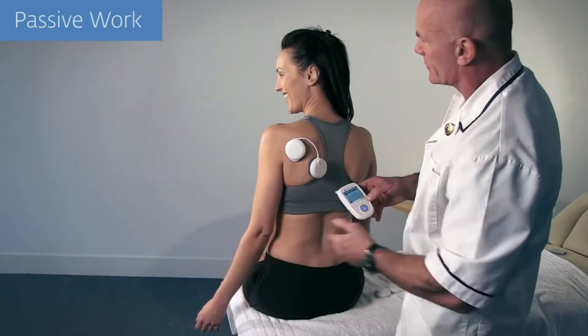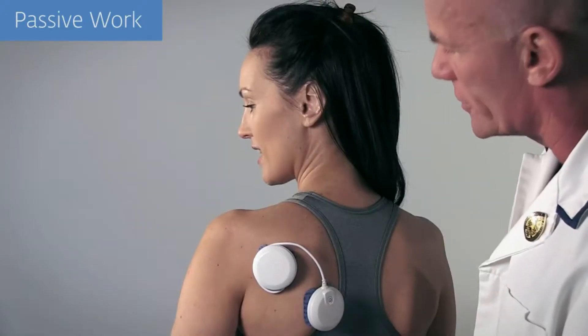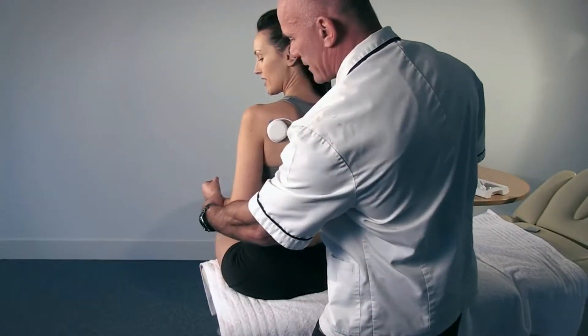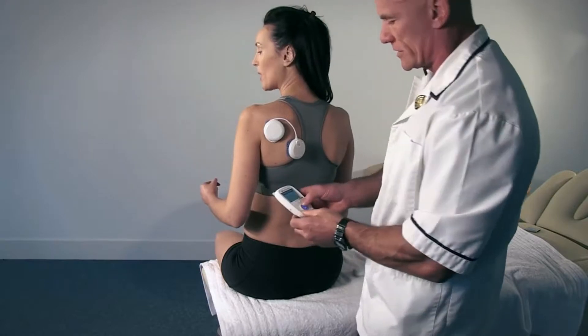The external rotators can then be worked isometrically using the internal rotators to hold the position. This produces a co-contraction of both the internal and external rotators.